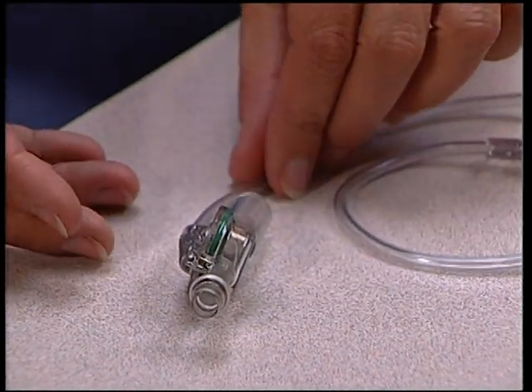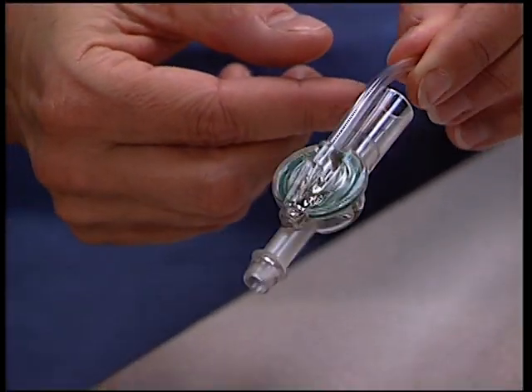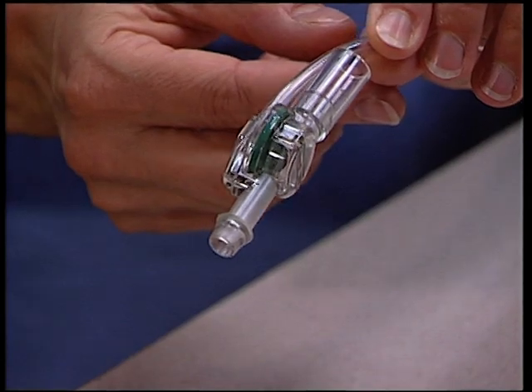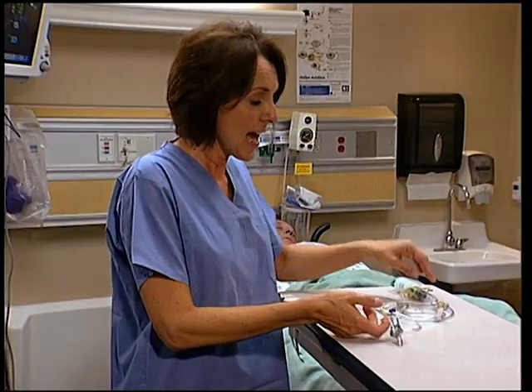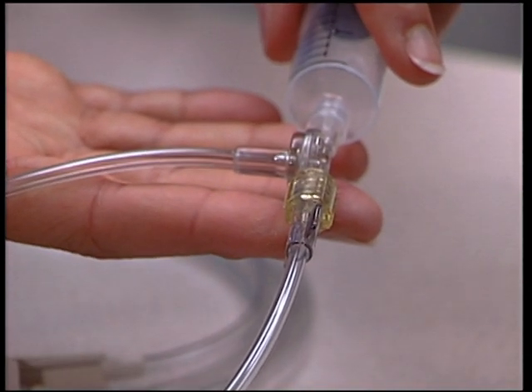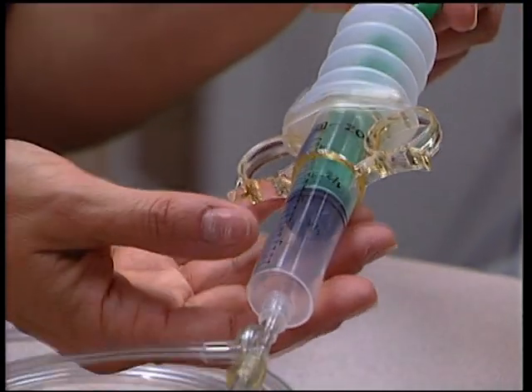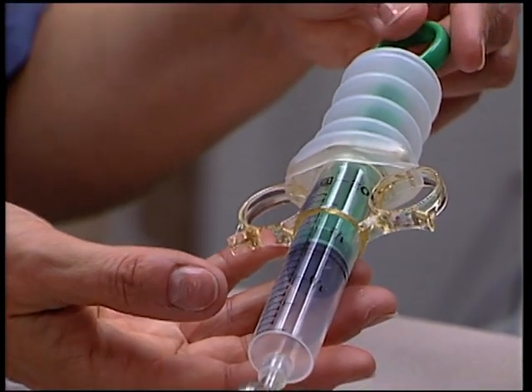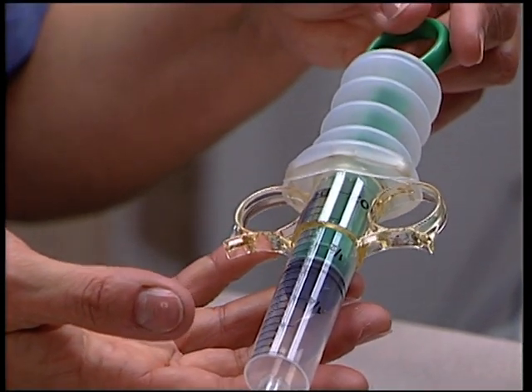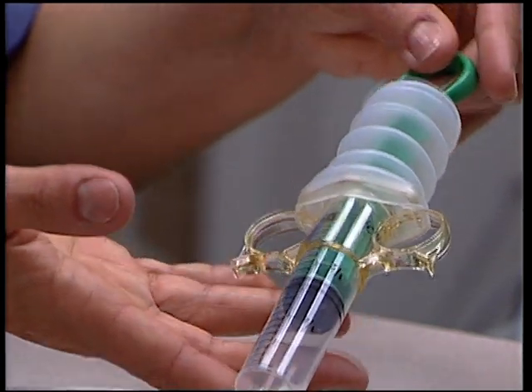First, the AbVisor auto-valve, which integrates easily with the patient's existing Foley and drain bag. Next, a unique double-check valve on the infusion line simplifies aspiration and infusion. And finally, a syringe with a contamination shield enhances the closed system, helping to reduce nosocomial infection risk.